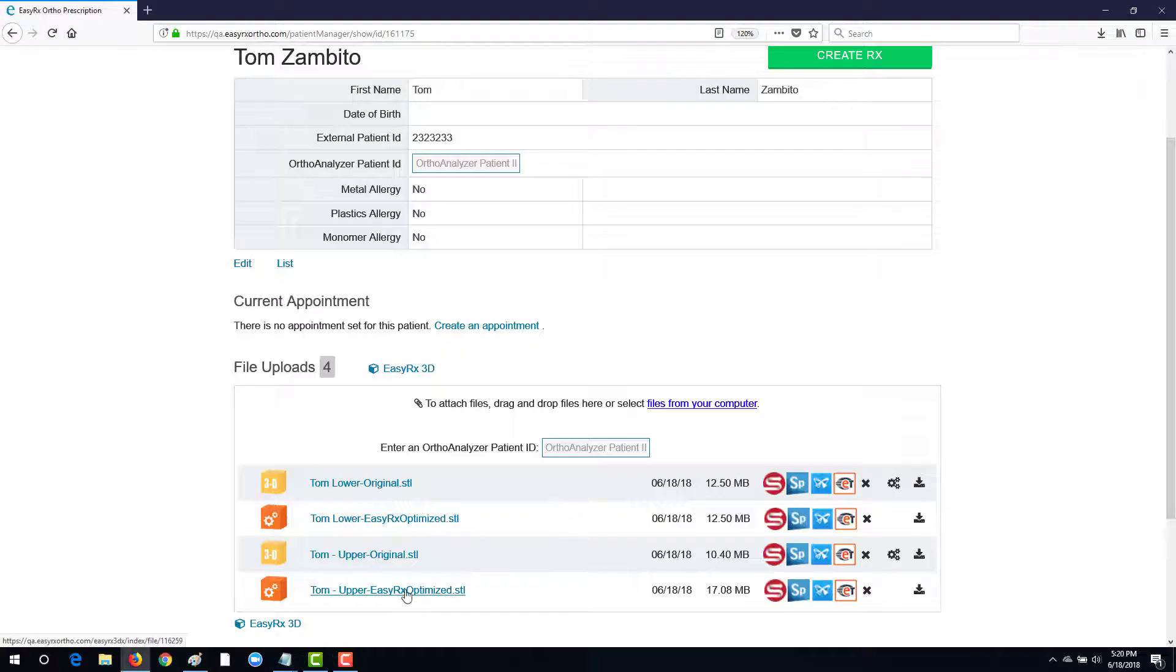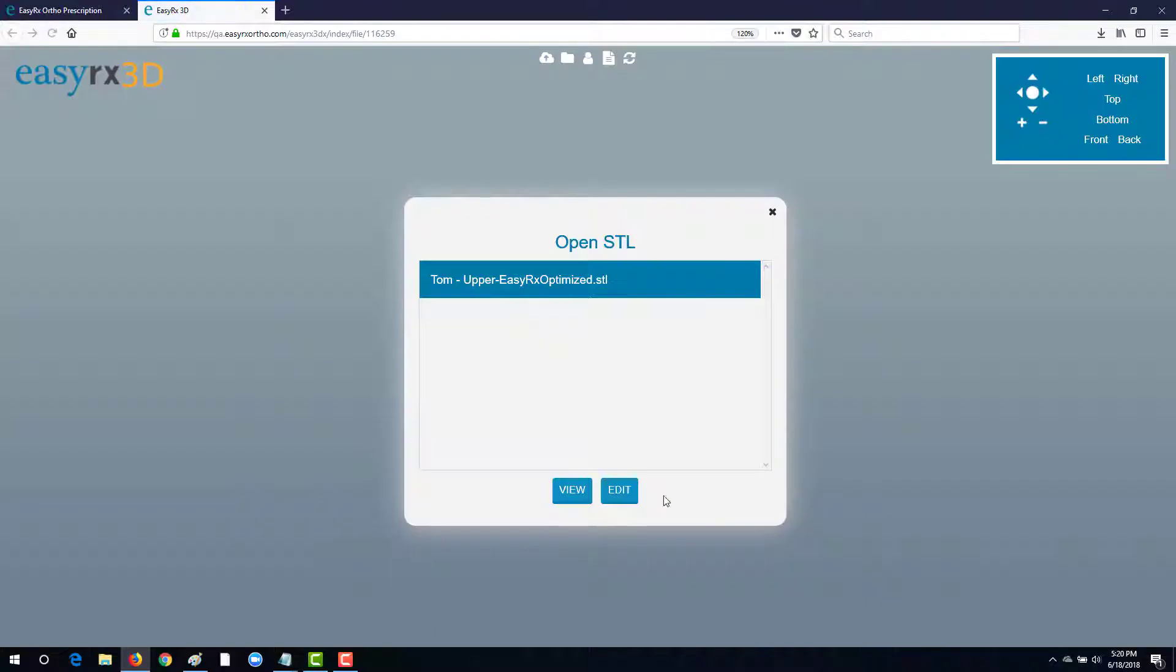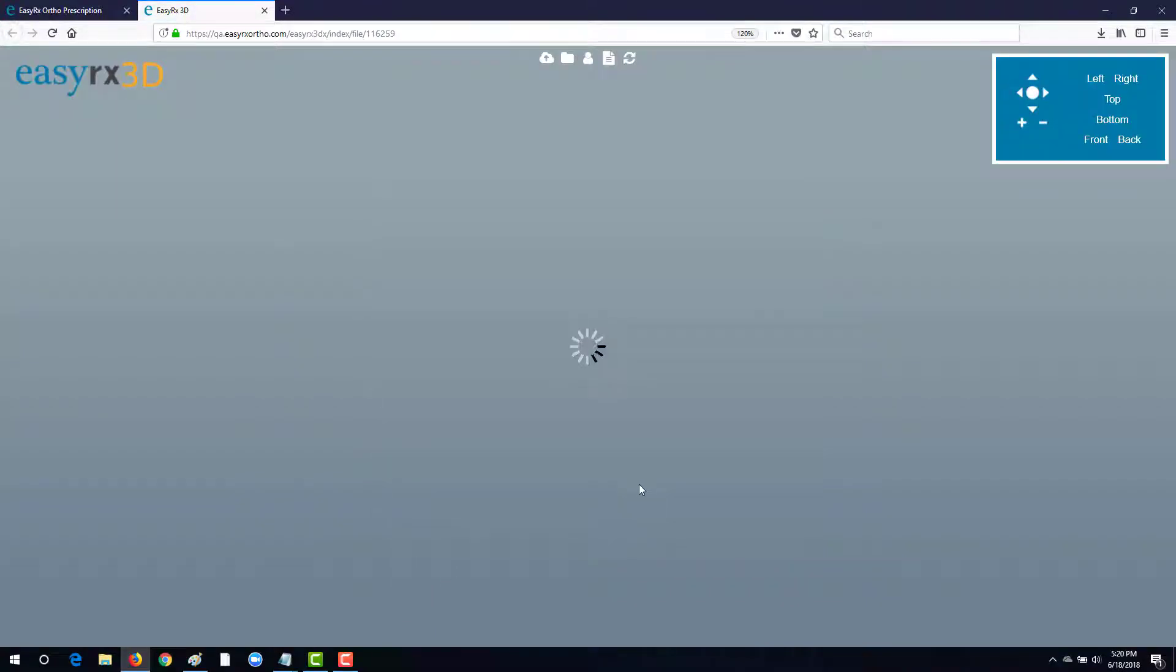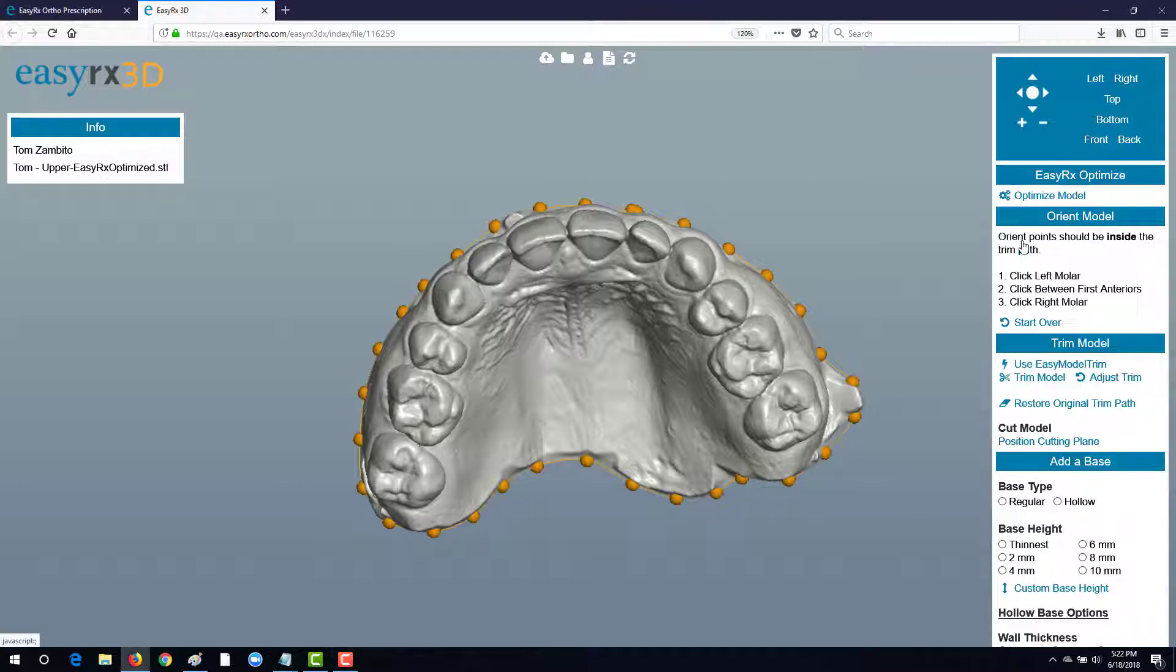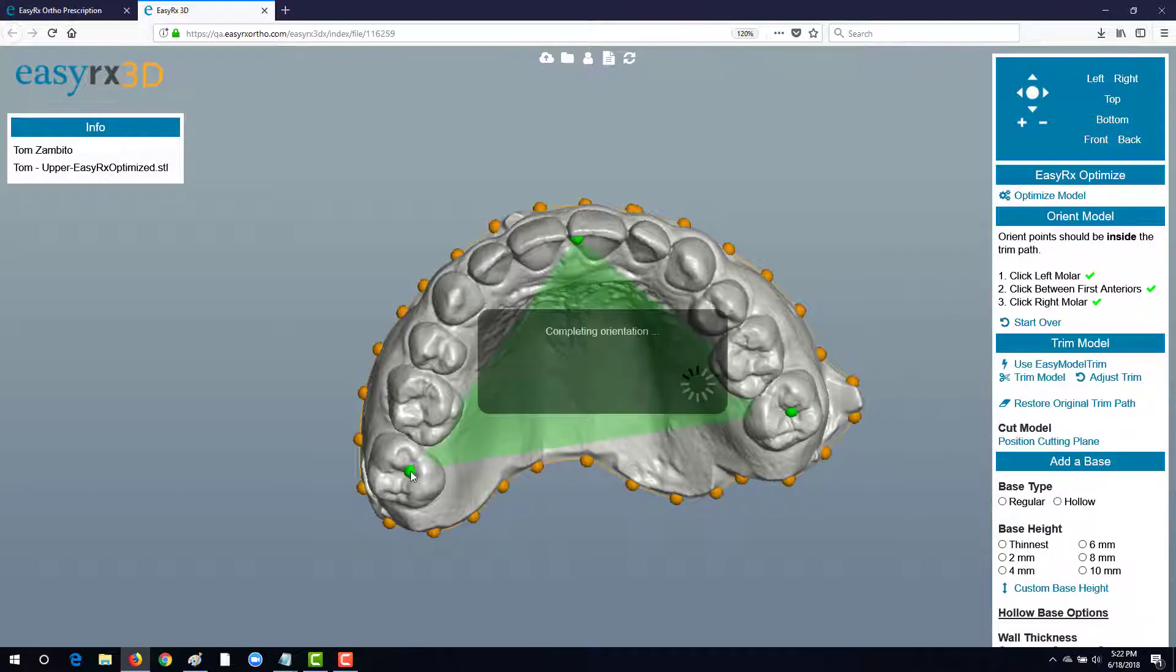Let's select the file to open up the 3D editor and begin editing. With the model open, we can first orient the model by following these simple instructions.